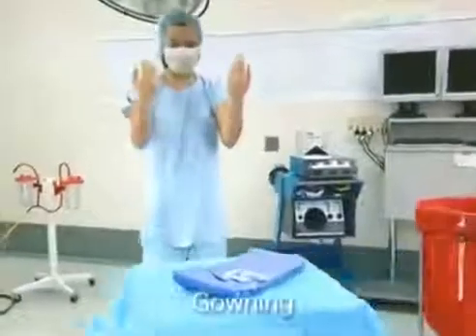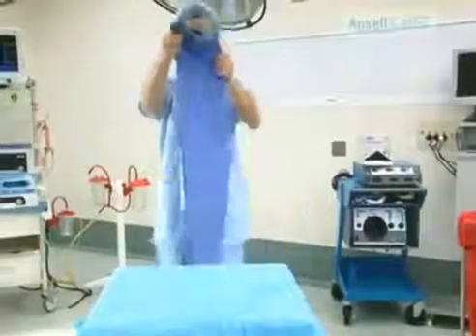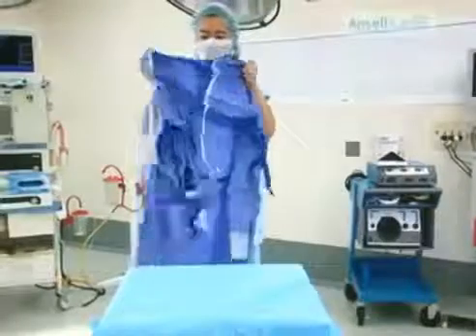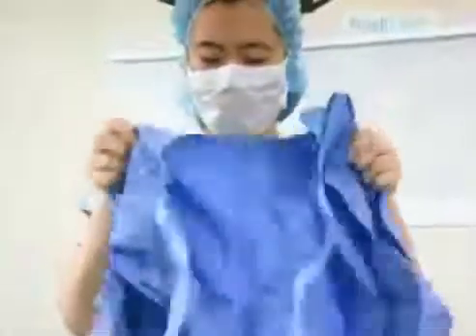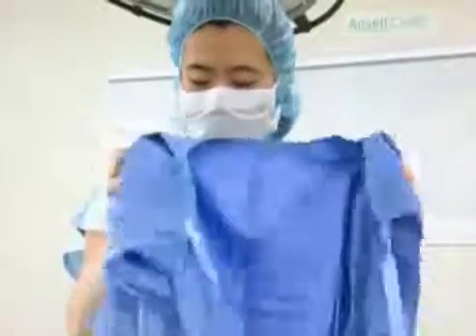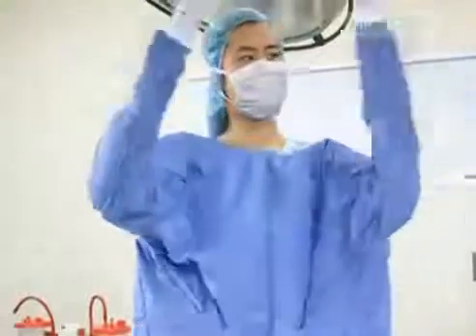Without touching anything else, pick up the gown and locate the neck. Step back and allow the gown to unfold. With both hands, find the armholes. Hold at the top corners of the armholes and gently shake out. One at a time, place each arm in the sleeves, stopping at the cuffs.